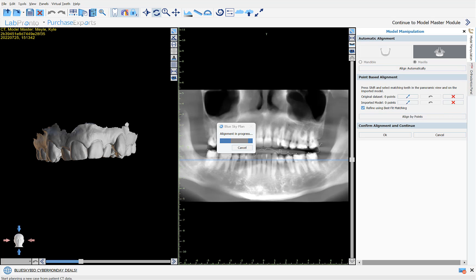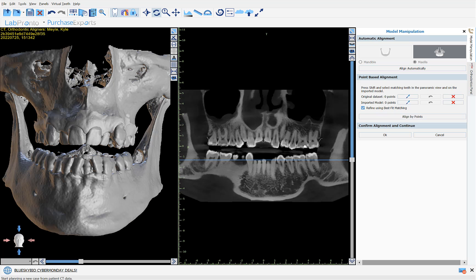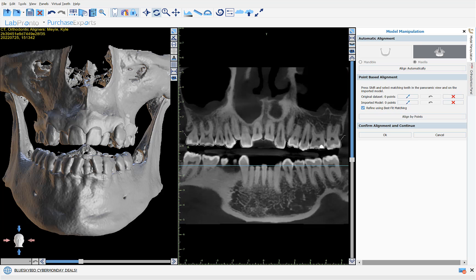The software then proceeds to run the automatic alignment between the CT scan and the model scan. In our 2D and 3D views we can see that the software has successfully aligned the STL model scan to the CT scan, so we can click OK to confirm alignment and continue.